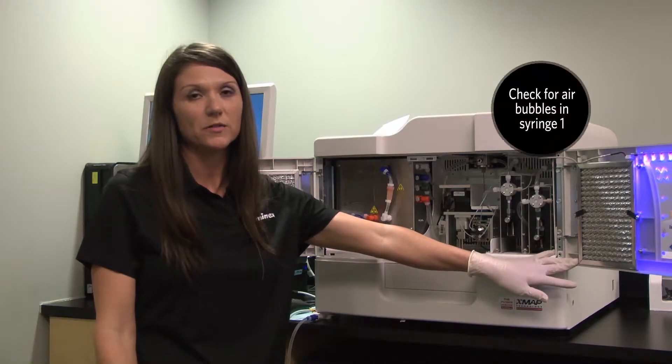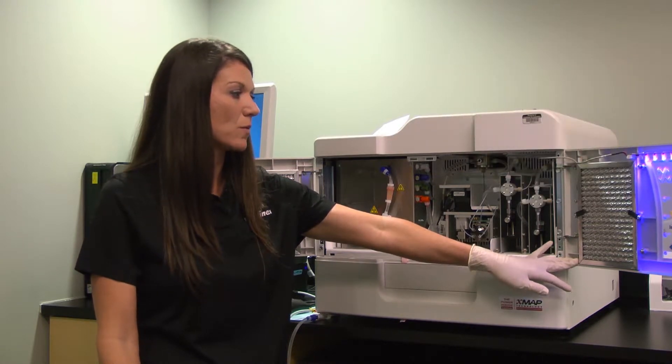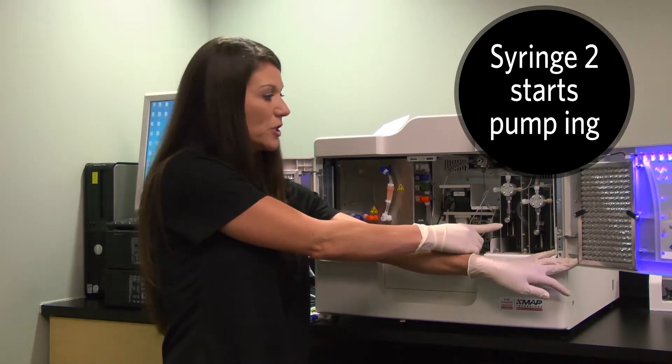What we're looking for in the syringe 1 pump is to make sure there's no air bubbles in the syringe. Once syringe 1 is complete, it will now move on to syringe 2.